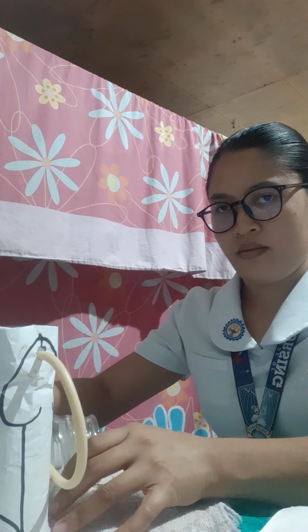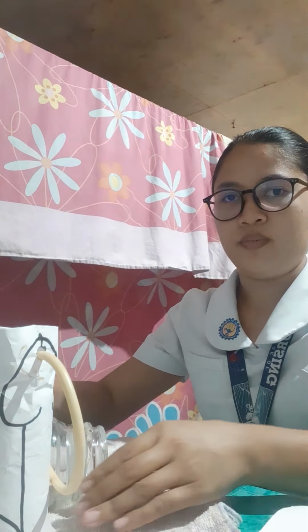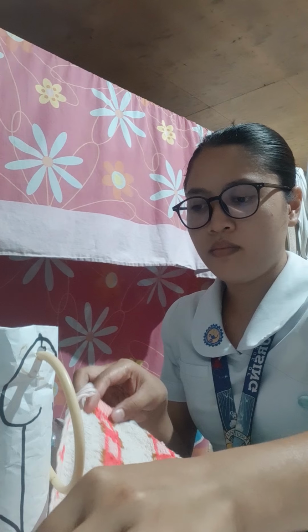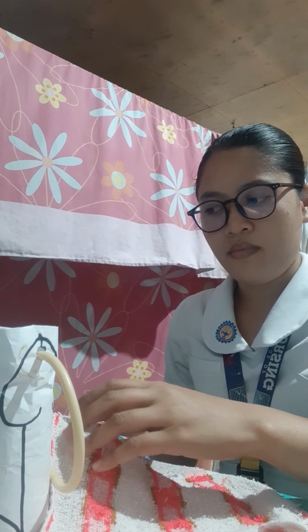Next, drape the bath blanket on the patient so only the perineal area is exposed. Next, open the sterile catheter kit using a sterile aseptic technique, then put on sterile gloves.